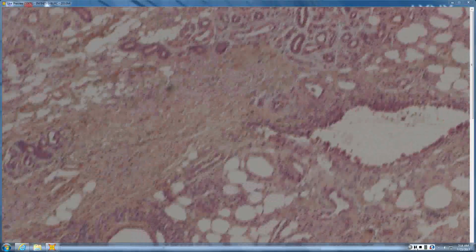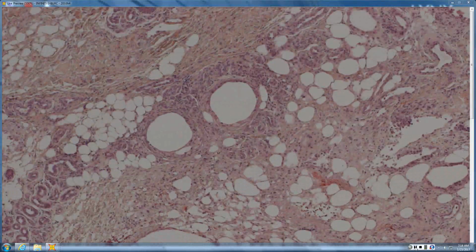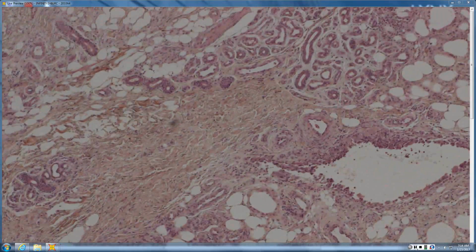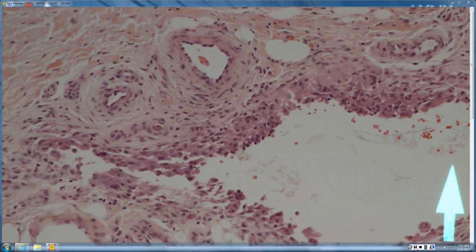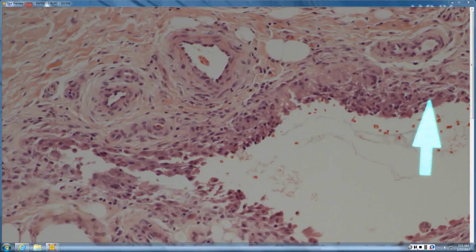So the fat does not look healthy, right? The fat doesn't look happy. So you have these kind of called microcysts. There's this microcystic change within the fat. So that's one helpful clue. And you have sort of a mixed infiltrate, and then you have these other areas that have kind of this change going on within the microcyst. Right, so there's some kind of histiocytic inflammation around this area of probably degenerating fat.